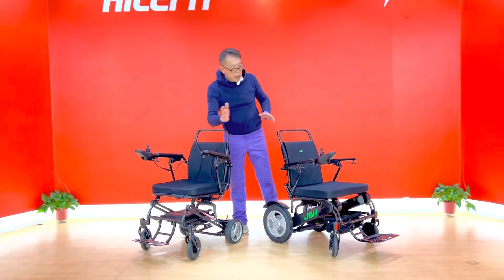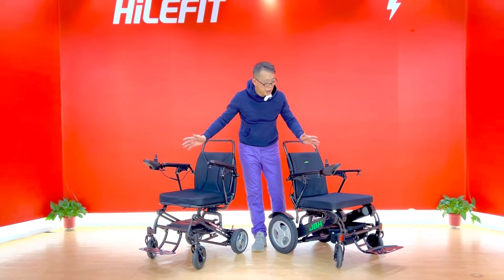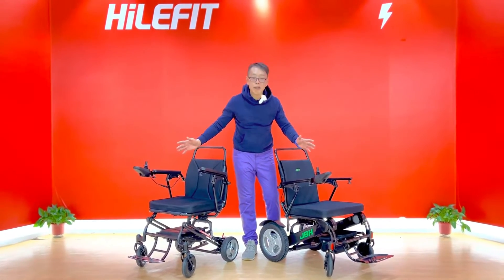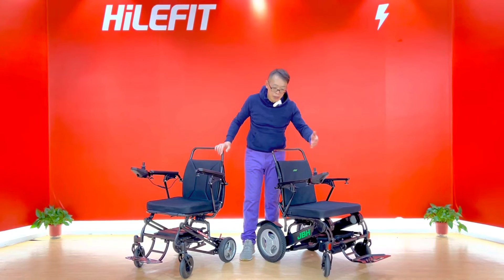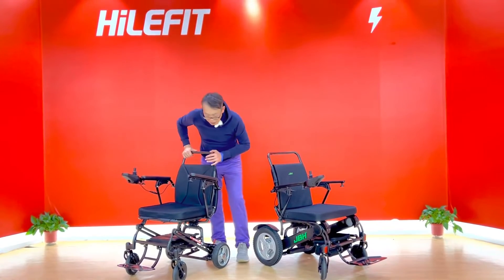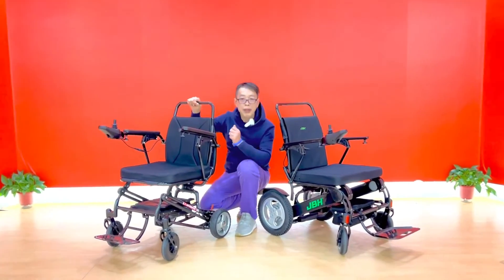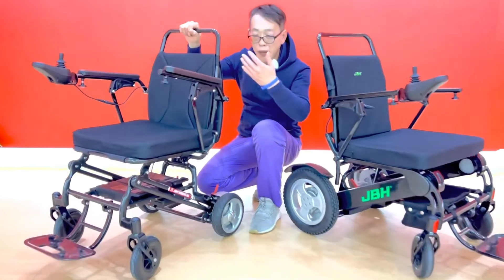They come with the same kind of controller, which has been on the market for a decade. We have the ability to make it our own. And look here — the battery: one, two, three. Three batteries that allow you to run longer.